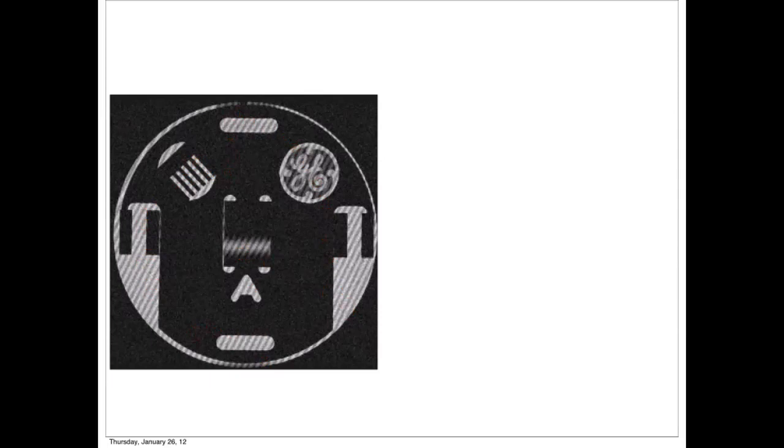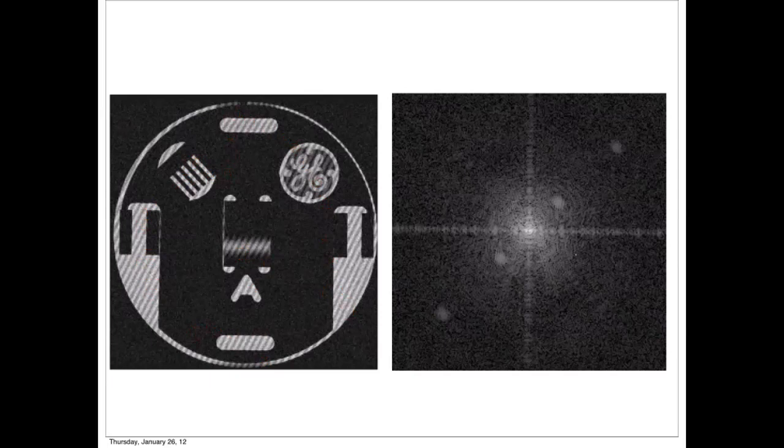Nice. That's right. If you compute the two-dimensional Fourier transform of this and look at k-space, it's very hard to see, but I'm going to emphasize the spike. There's actually a bright pixel over here, a single bright pixel in the frequency domain. That's sometimes caused because gradients switch and create a spike, and the digital-to-analog or analog-to-digital converter would saturate and create a white pixel. So that could happen. And because there is a spike here that corresponds to a complex harmonic, that's exactly the amount of ripple that goes here. Now the question is, what's the Fourier transform of a complex harmonic? There are a lot of subtleties in this image. What's the Fourier transform of a complex harmonic?